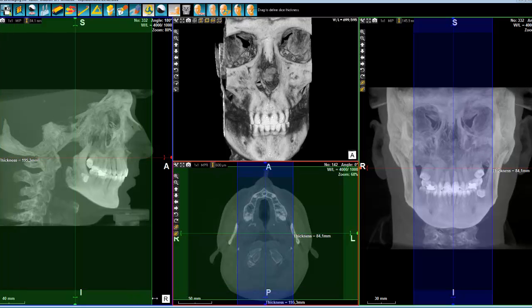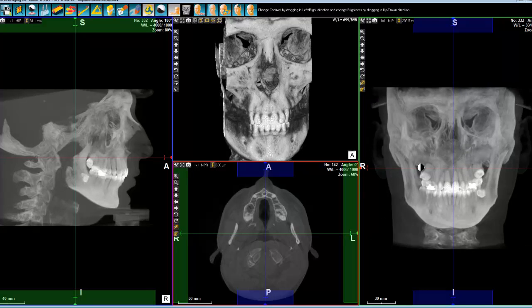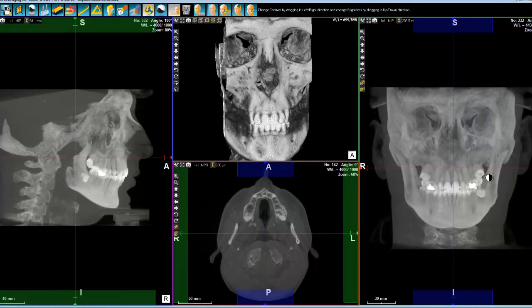It's just a simple module that will give you an image that you are used to. You can select the view and change the windowing, which will enable you to visualize in a better way. That's it for the AutoCef module.